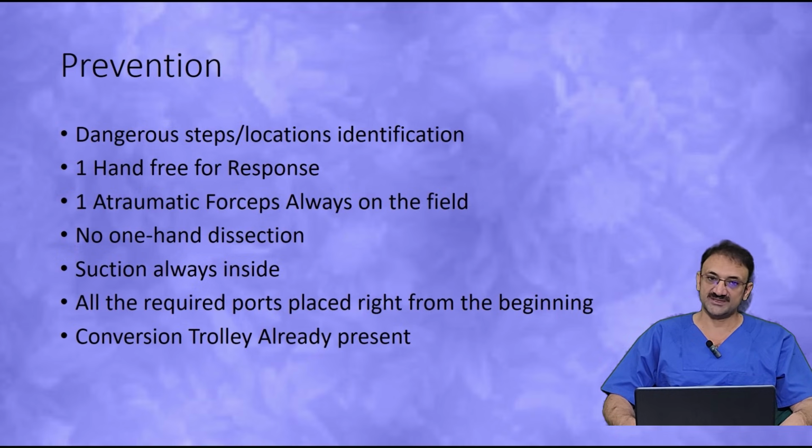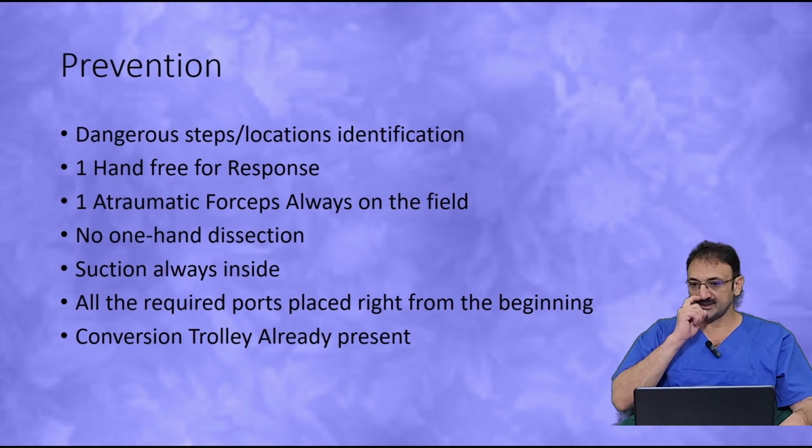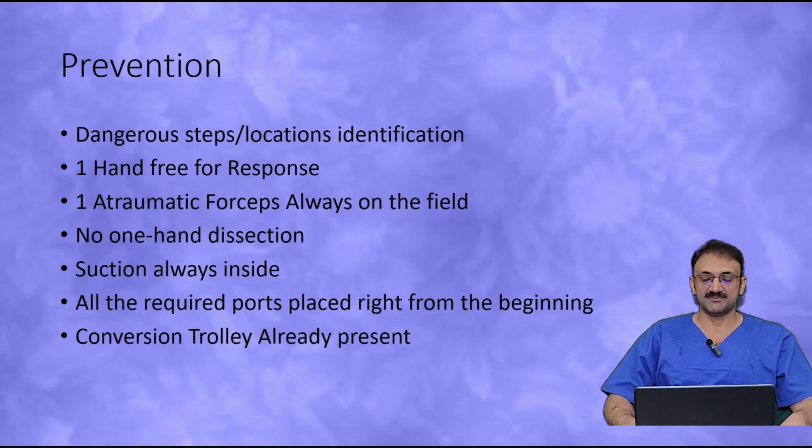Suction should always be inside, so that if anything like that happens, the blood will be collecting there. So suction has to be there to remove all that blood, to visualize the area from where the blood is coming, and secondly, to improve the vision as well.